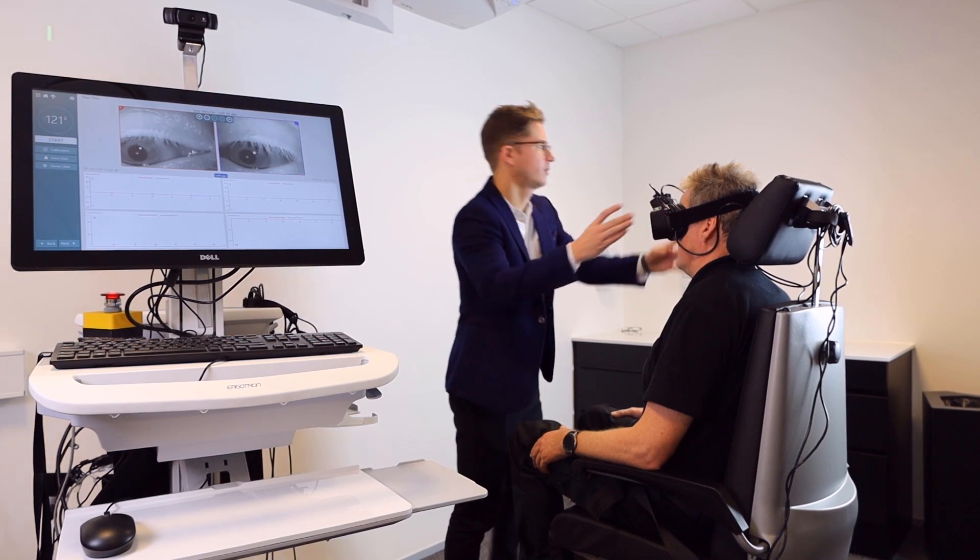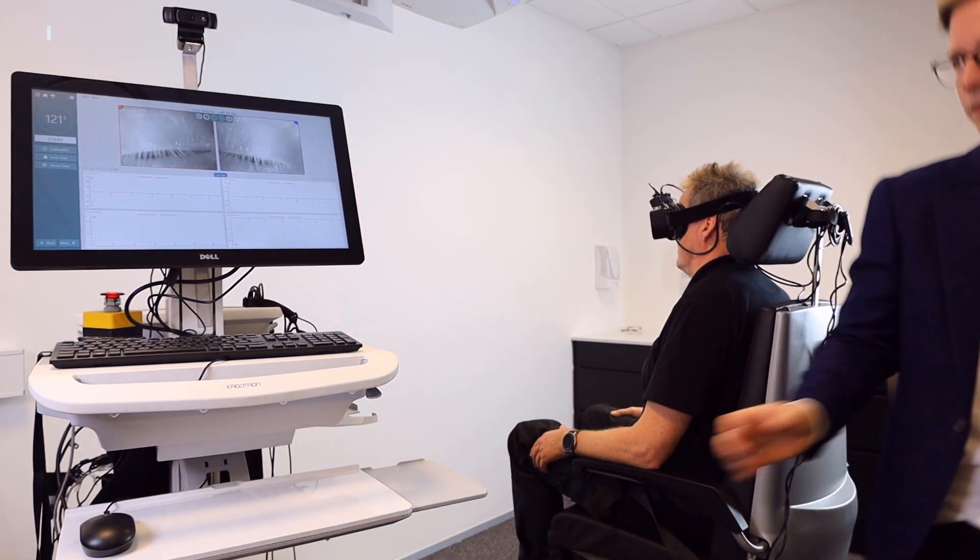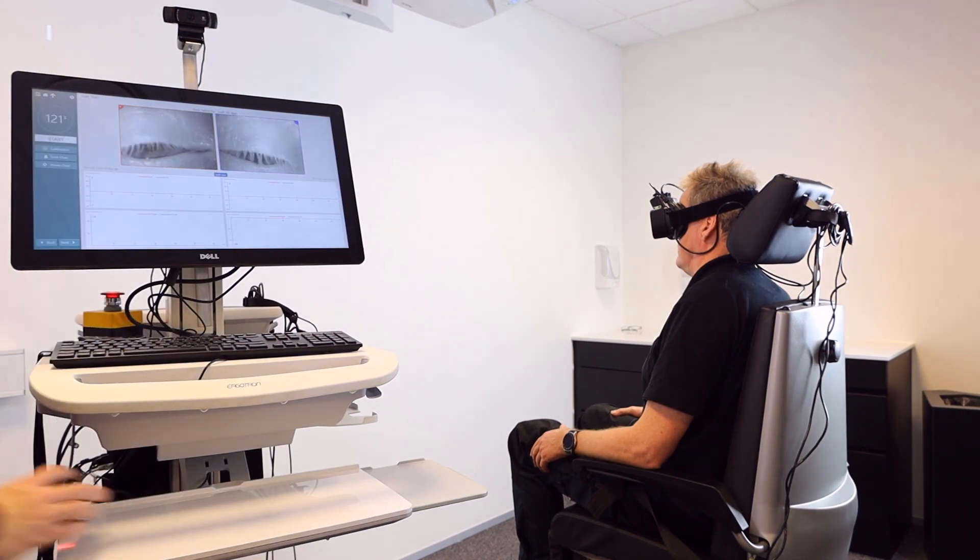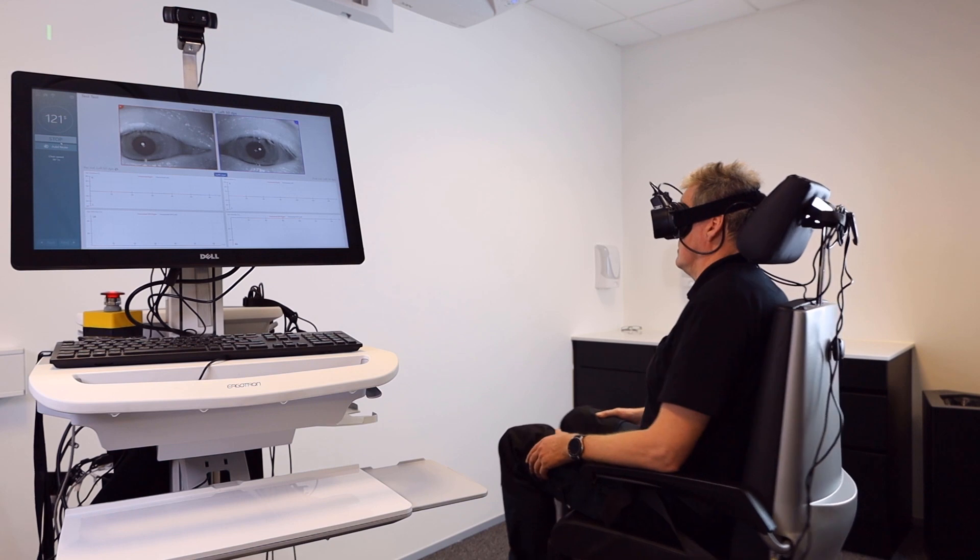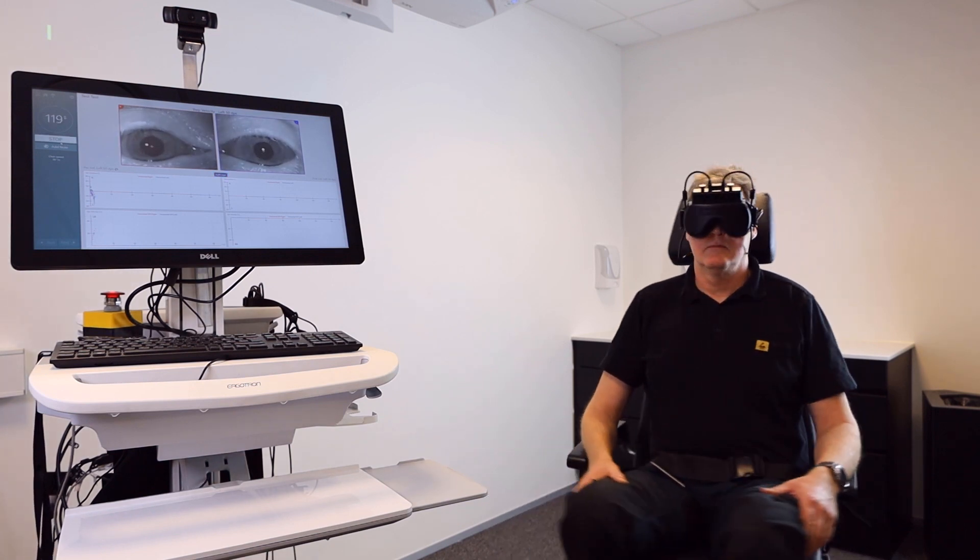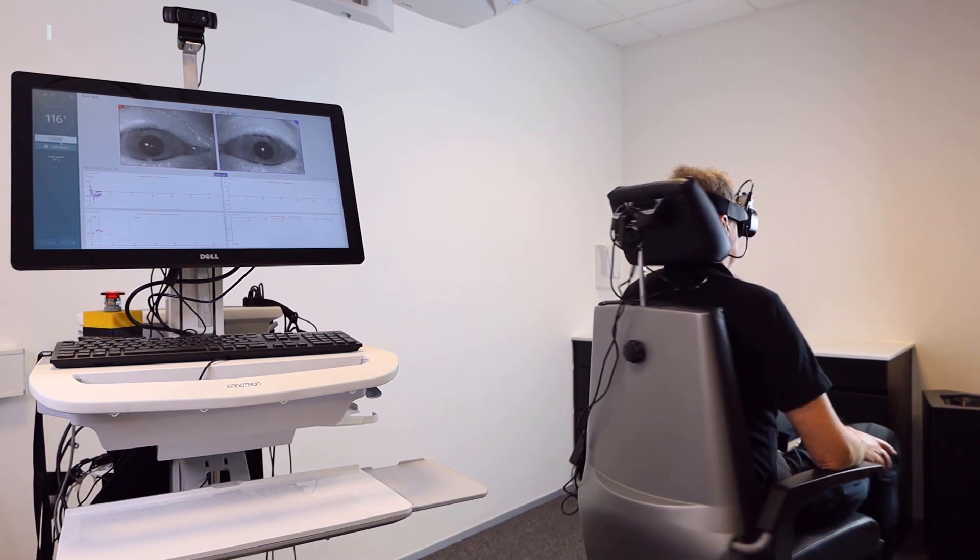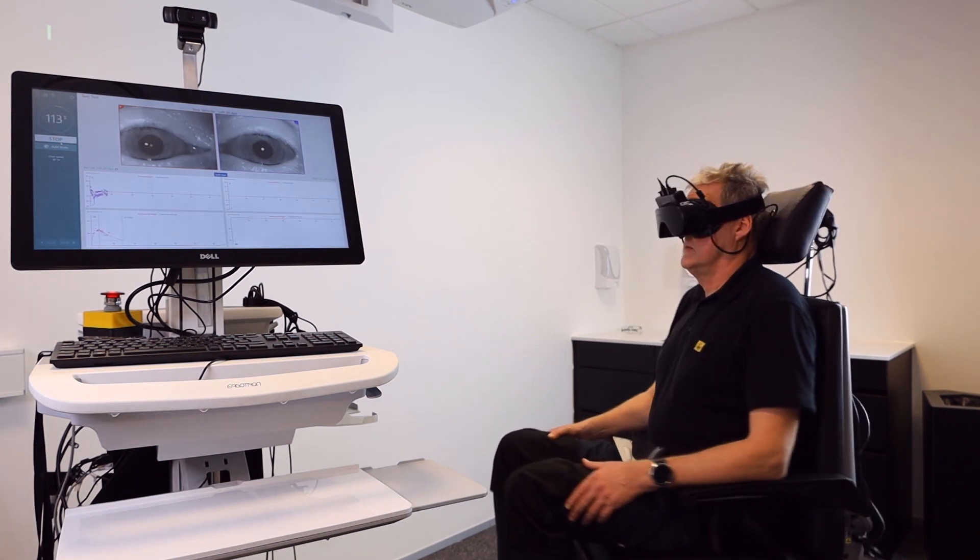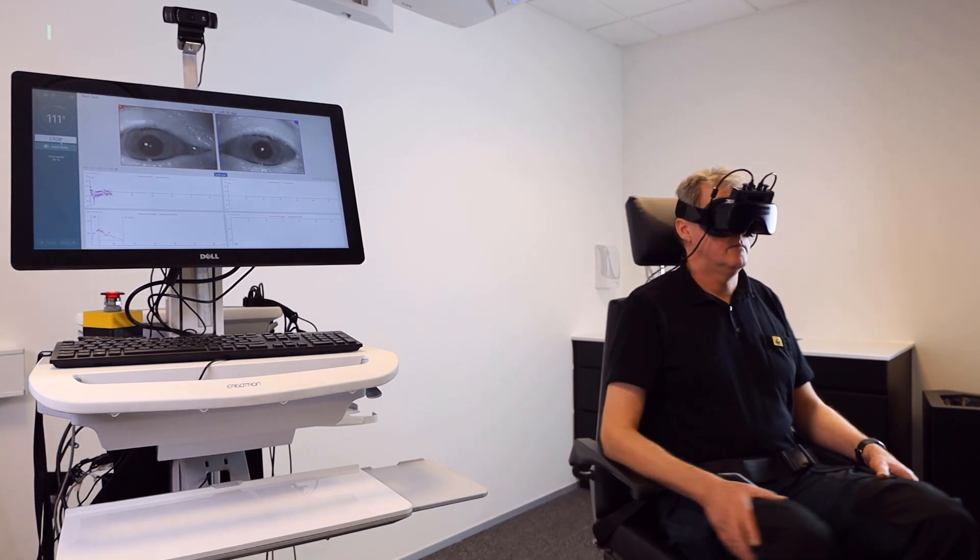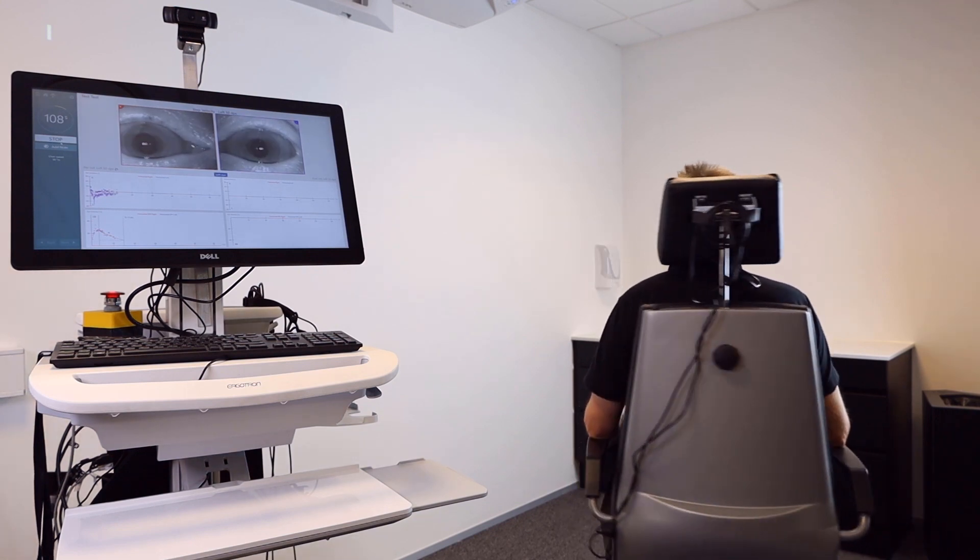The velocity step test is a test of vestibular ocular reflex on the rotary chair. It's performed in darkness with the goggles on, and the patient is given a mental alerting task. Let's start again from the beginning. Let's do boys' names beginning with A, and then B, then C, 110, D.